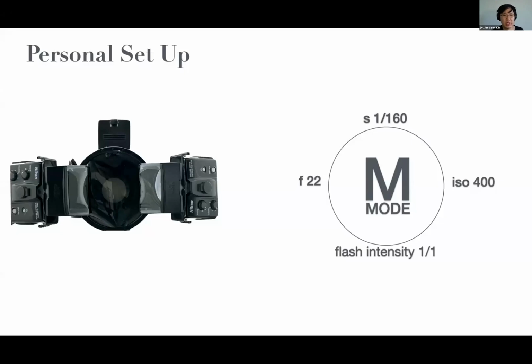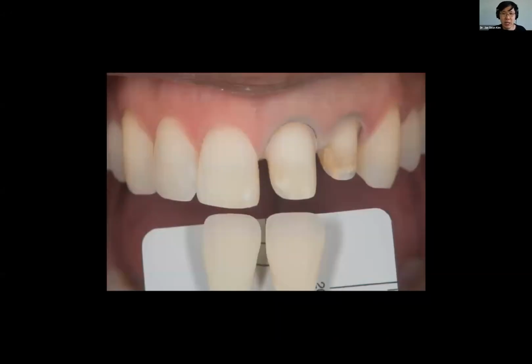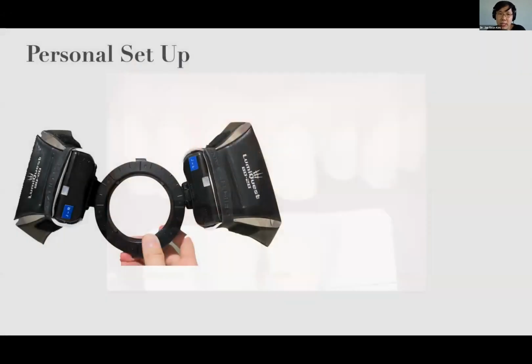Just be creative. That's why you need to know how to change settings as you go on, because not every picture is going to turn out the same always. So here is a picture with a polarizing filter that I've made at home. And you can see that it cuts out the glare. And we'll talk about this a little bit more.